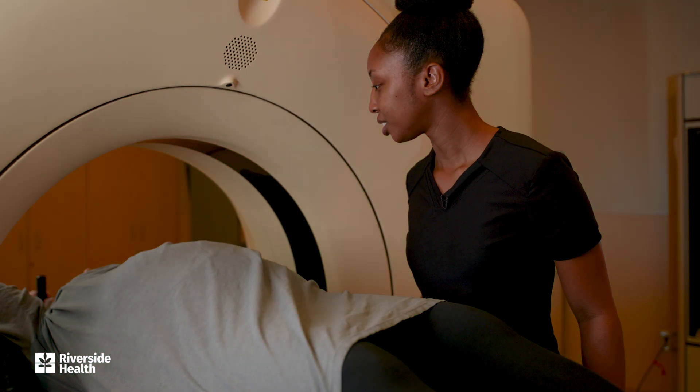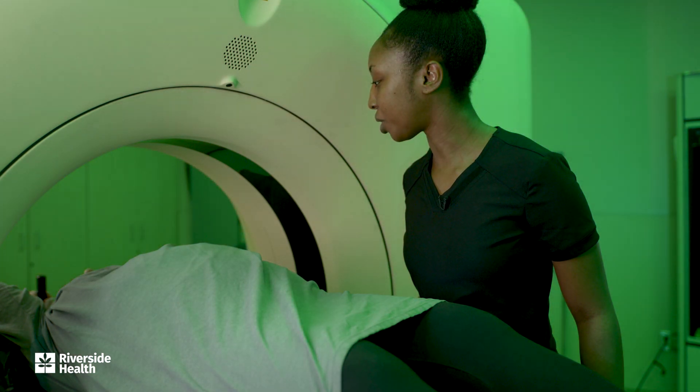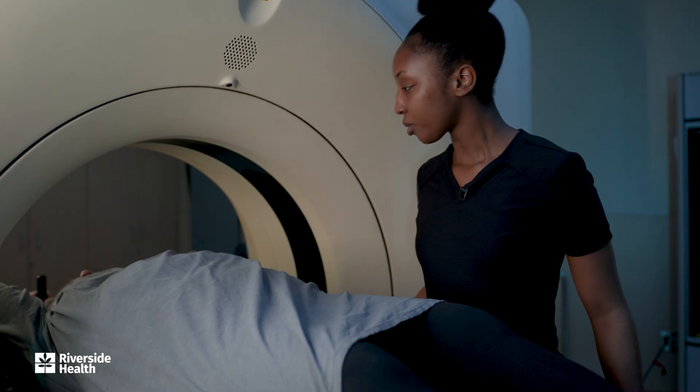Green means good. Now exhale slowly. The orange means that you've inhaled a little too much. So when you see the orange lights, you want to exhale slowly until you're comfortably back into the steady green lights.